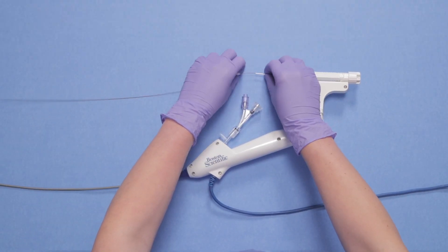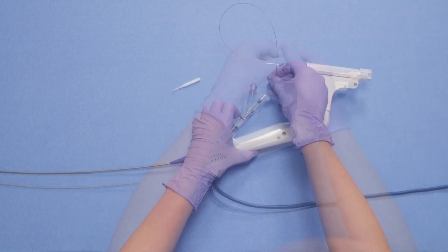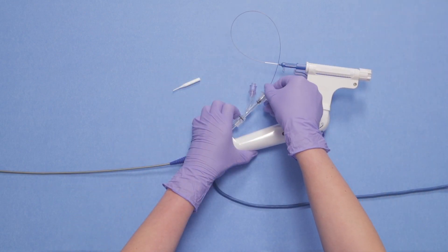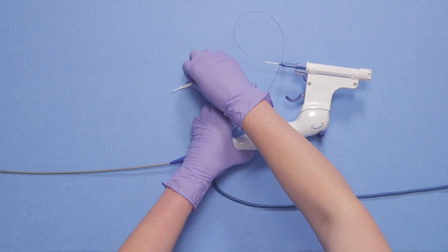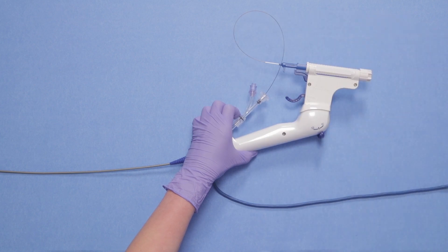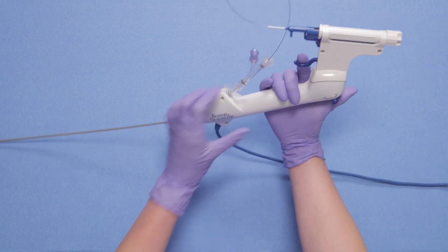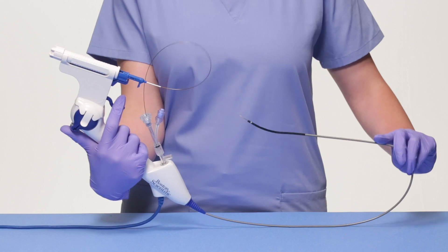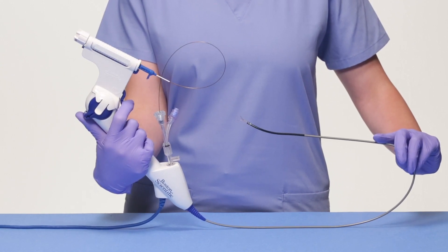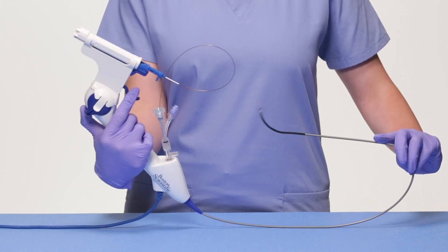Then, feed the basket through your scope adapter. Ensure the adapter is completely open before feeding your device through or use an introducer. Please note that if you are using an adapter other than a TUI Borst style adapter, you must use an introducer to insert the basket into the working channel of the scope.